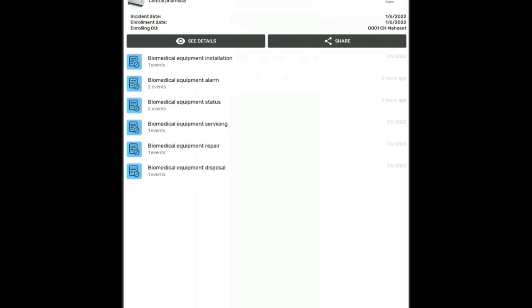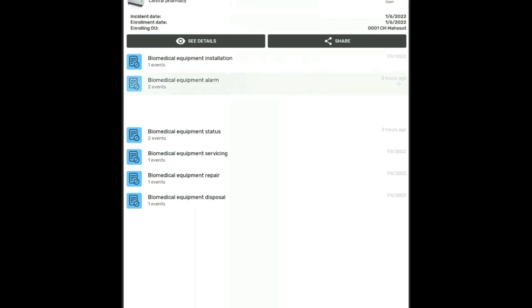So here you are able to record the installation, record an alarm, record the status. The entire lifecycle of equipment is covered until the disposal.